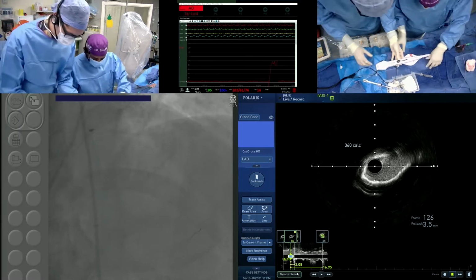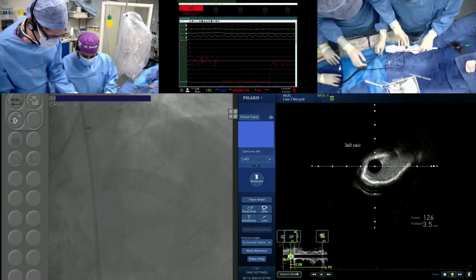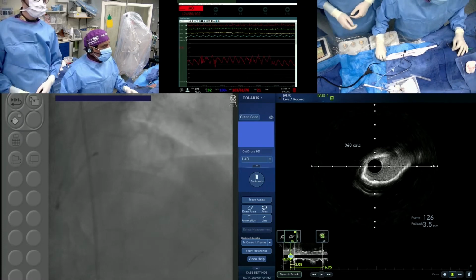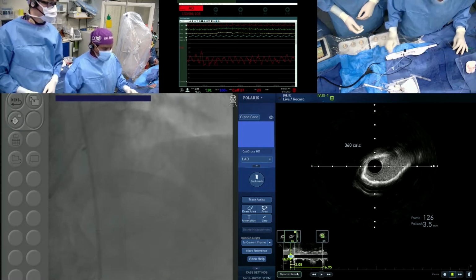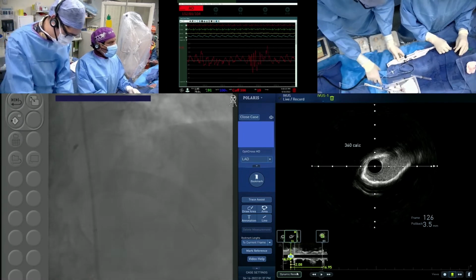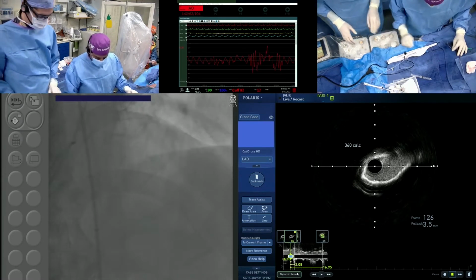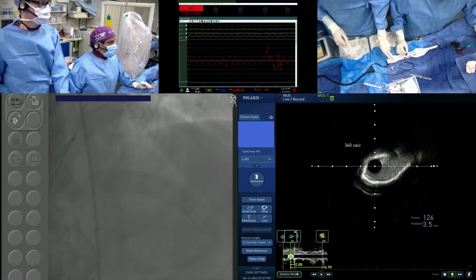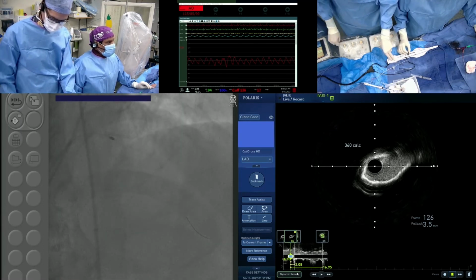Good. So now, the speed check outside, 150. We have the Rota Pro set up, 150 speed. And then from the technique point of view, first we have to pull back the wire. Wire is quite good. Yeah. So now, once we have the proximal, three things: the advancer knob, the Y connector, simple thing. An idea there is that it will prevent jumping, and just a tap on the Dynaglide and it will not jump. So with that note, we are ready to start. We have a 1.75 burr ready, although it probably would have taken a 1.5. We'll see. If we see some resistance, same packing.